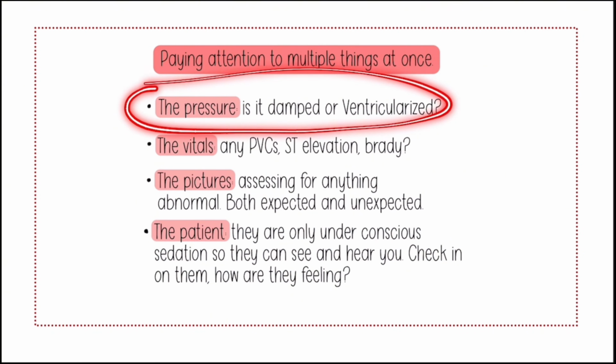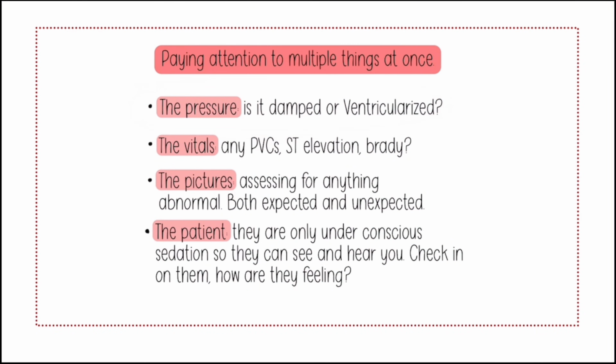So for instance, you need to pay attention to the pressure. Is it damped or ventricularized before I inject? The vitals, are there any PVCs, ST elevation, or bradycardia before I inject? As we are doing the procedure, are there any changes with the patient? The pictures, we're looking for anything abnormal, expected, and unexpected. And the pictures that you're actively taking, or a picture you just took if you're reviewing them. The patient, they're only under conscious sedation, so they can see and hear you. They can respond to your commands, so you can check in on them and how they're feeling.